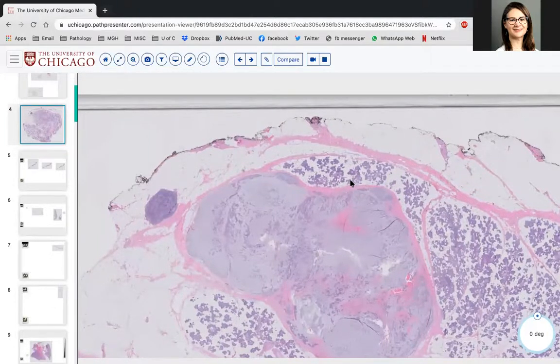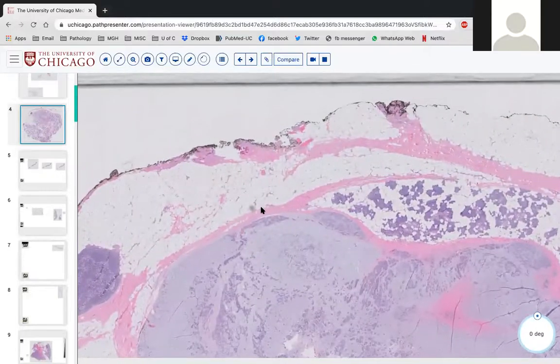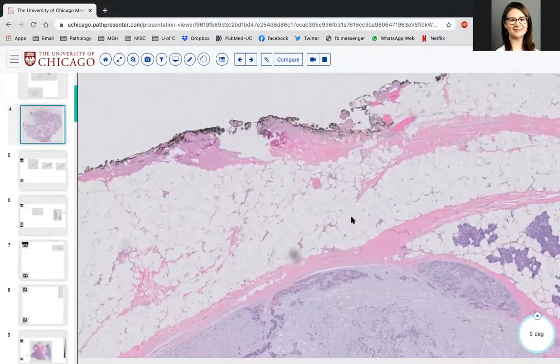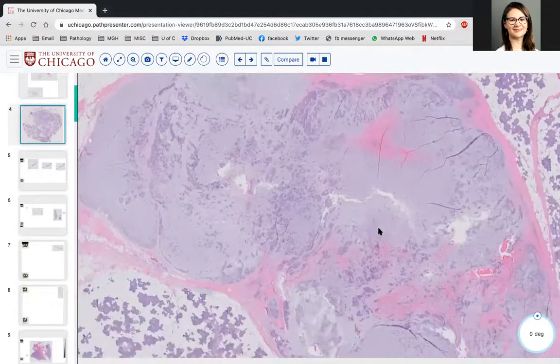Just resection? Just resection, exactly. So just resection with margin. I mean, the surgical management implied surgery. Yes, well, generally salivary glands are surgical diseases, right? And so surgical management can range from just resection of the tumor to resection of the tumor plus the neck dissection, if we're thinking about a high grade. Yeah, exactly. So here we have a surgical resection of this particular specimen.